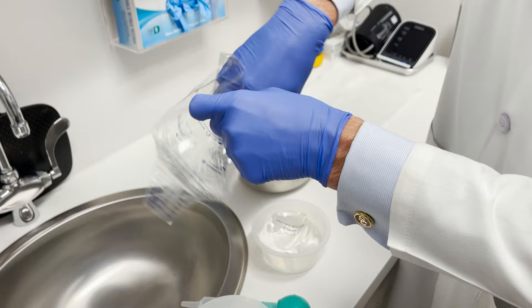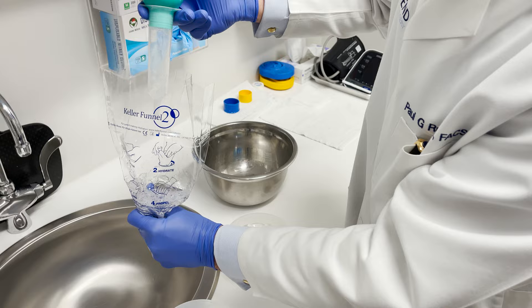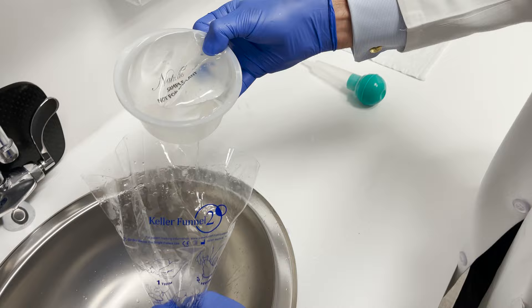With a little bit of solution, I'm going to do that with this little aseptic syringe right here. We lubricate the funnel to slicken it up, just like this, and let that go through. When we put an implant in, we open the little package directly into the funnel.